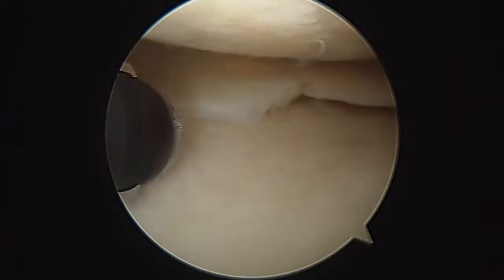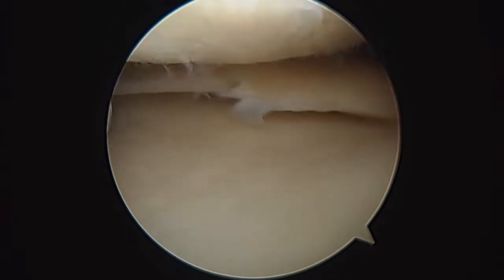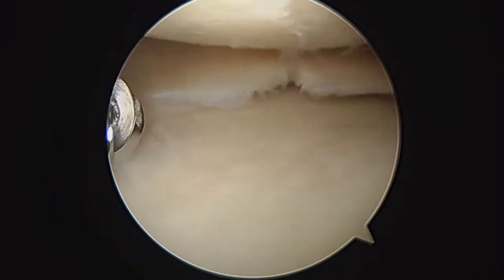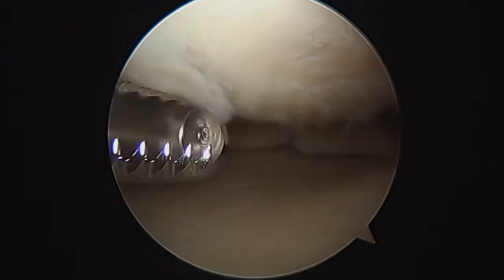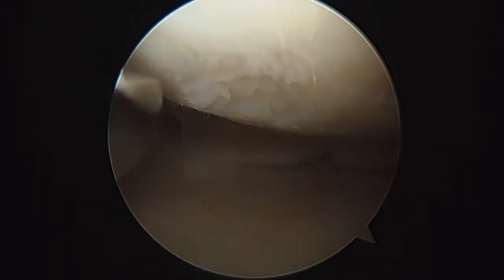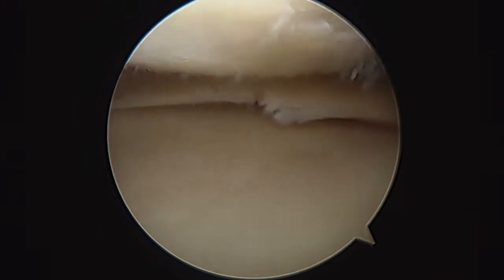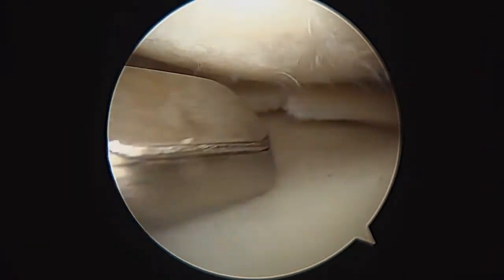You can see you've got this kind of radial meniscal tear, as I focus a little bit better. So we're going to take a pair of scissors — that's not really a repairable tear right there. You can see there's some thinning of the cartilage on the plateau down below, a little bit up above. But I think the most important thing on this medial side is that meniscal tear right there, and we're going to put in an instrument here that will help us take care of that.